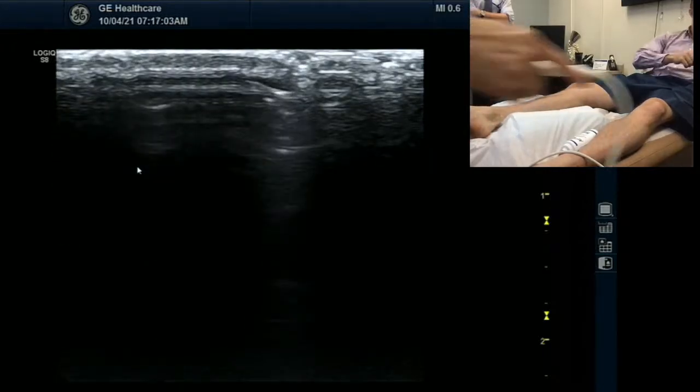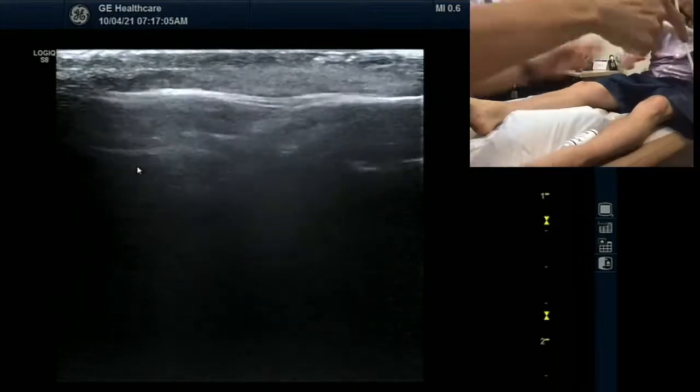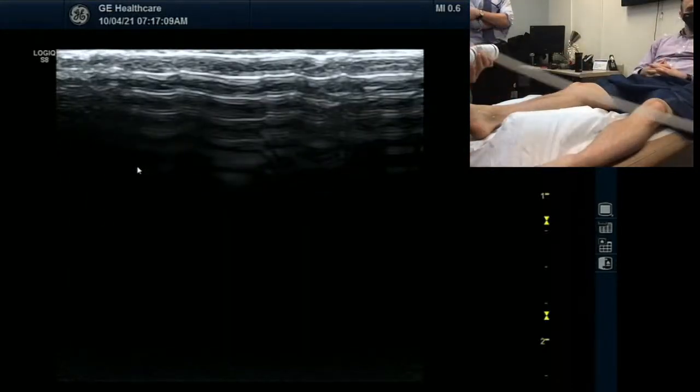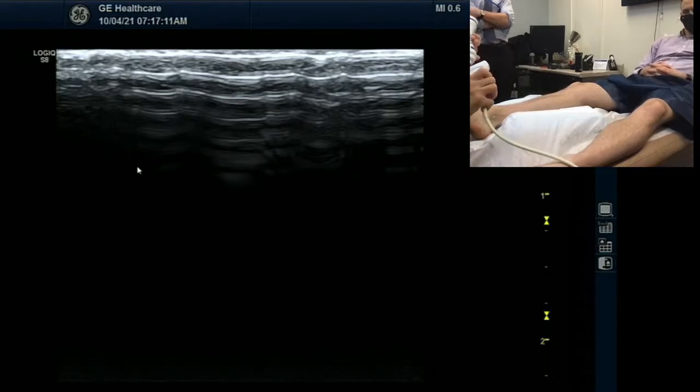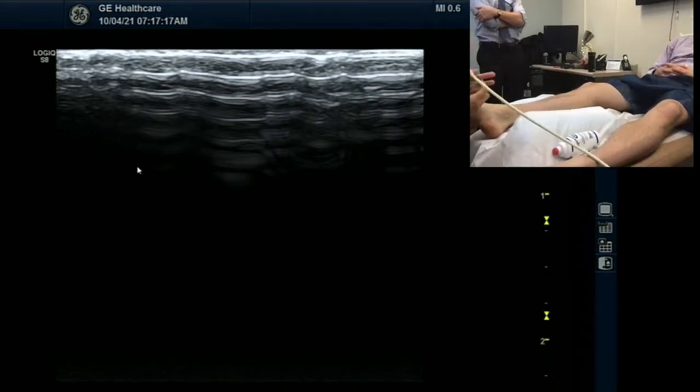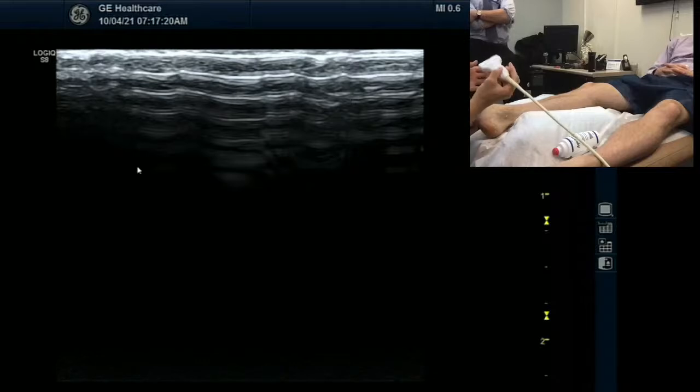Can you give me a linear probe actually? Linear. Let's try with linear first. Because sometimes I can cover more area, I can see more muscles. Patrick has a lot of muscle. I'm just trying to capture a portion of it. You have no fat — it's a problem. You're going to have foot pain. Too much muscle. Go chase the transducer.